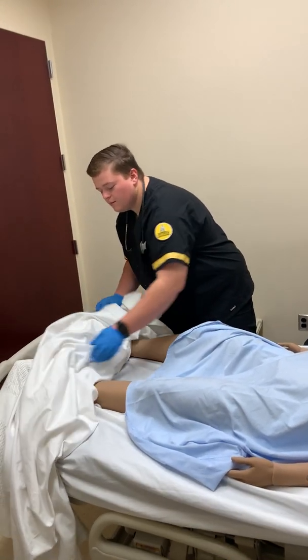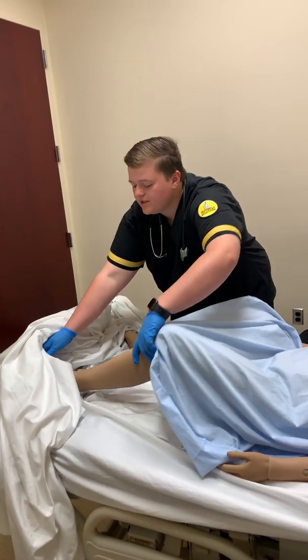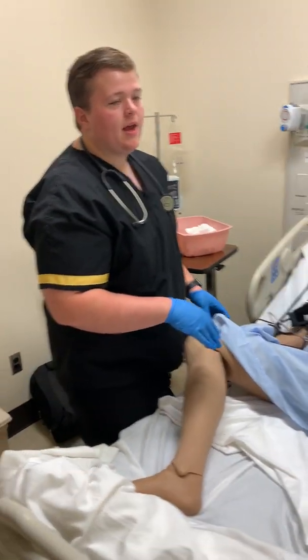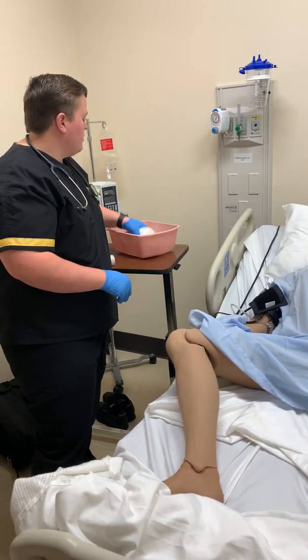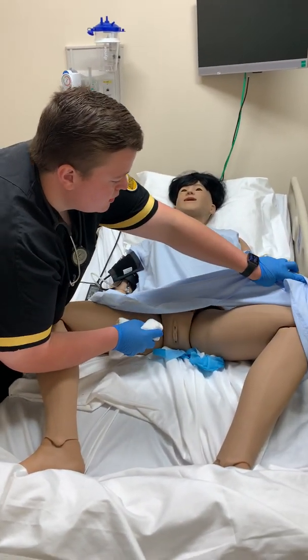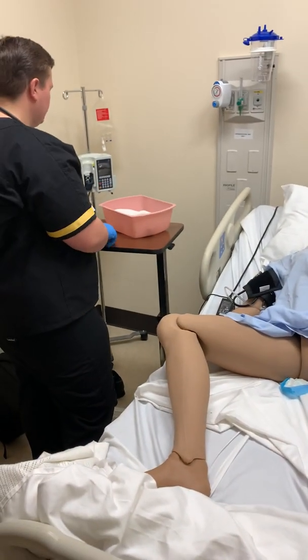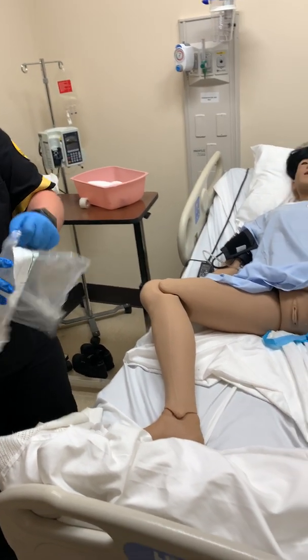And so I'm going to place Miss Smith in dorsal recumbent position. That's the correct position for females, and it's going to provide the most ease. But we're going to leave her draped for now to preserve modesty while we start doing our peri-care, and we are going to wipe from top to bottom. Alright. And so we're going to go ahead and get started.